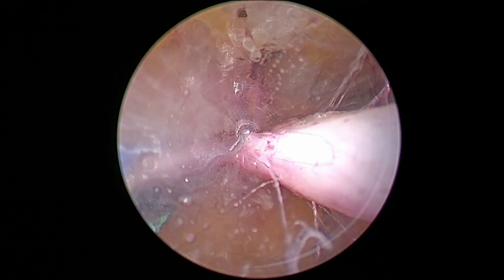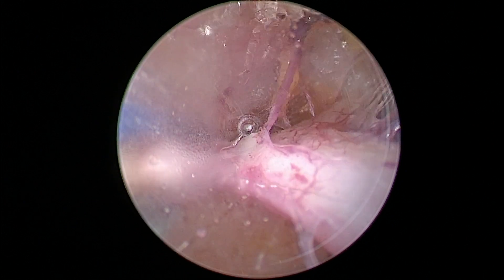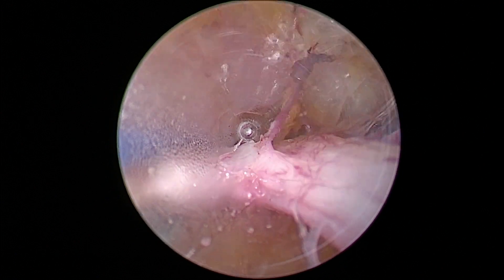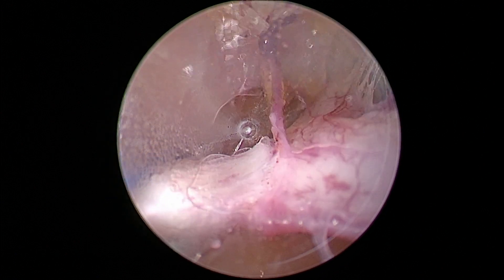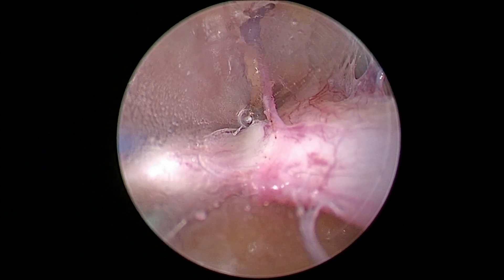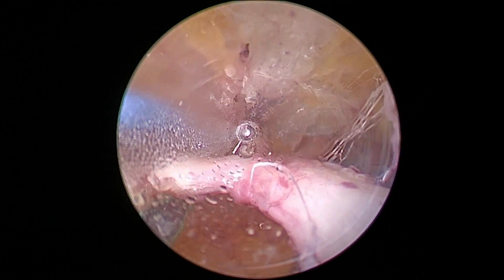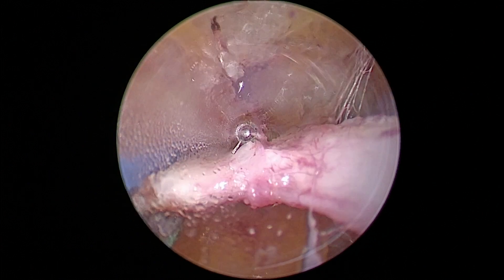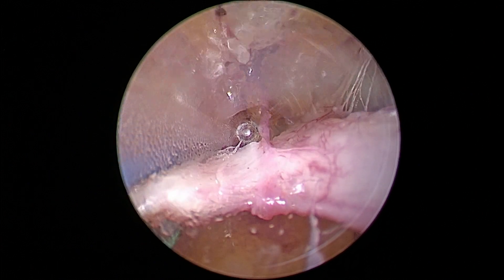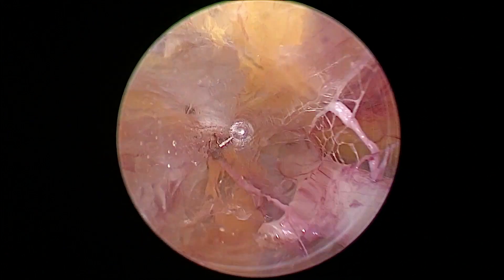Here's a branch where I did the pullback — this is the medial branch, which is a big branch. After I see no more spray during my cautery, there's just a little bit of tissue still there, and sometimes I just do a quick forward motion as I'm cauterizing, and then I'm done. Always keeping the branch in view.